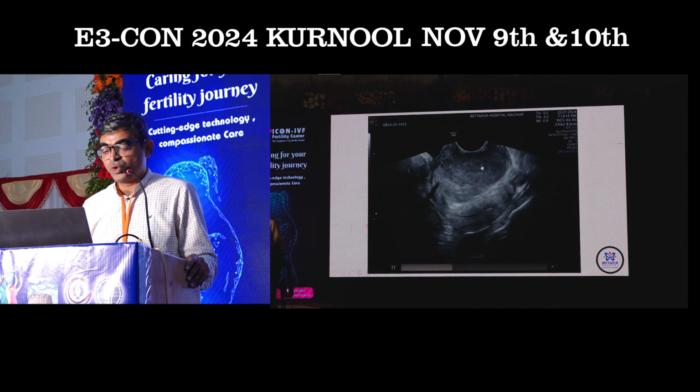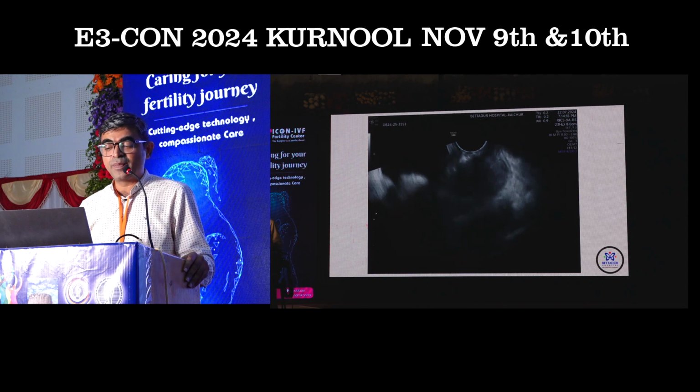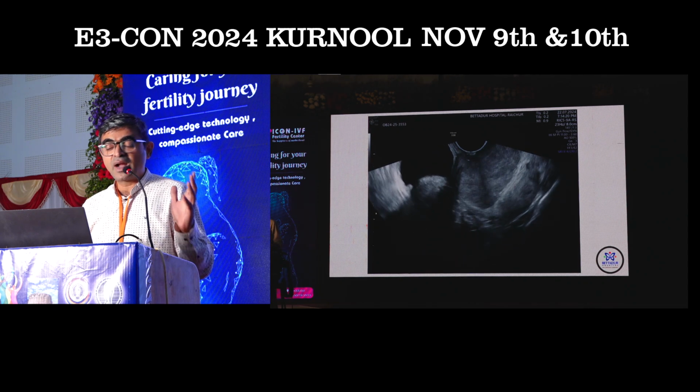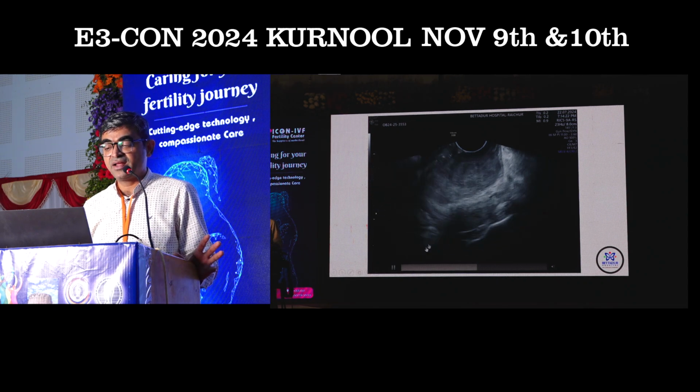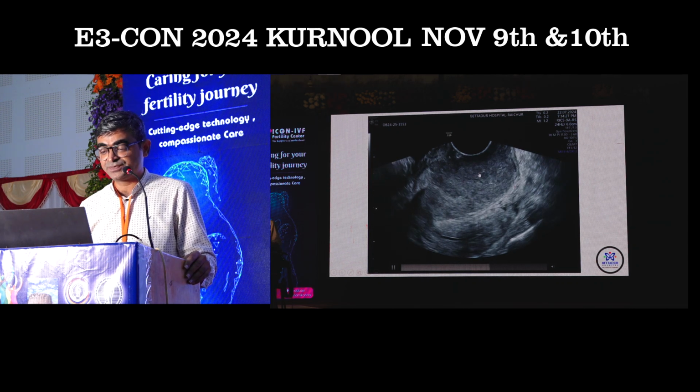When we put color, the color score will be more, and also you won't see a typical patterned, regular uptake of the color. It will be haphazard and more. So it is evidence to show that it is a case of CA cervix.